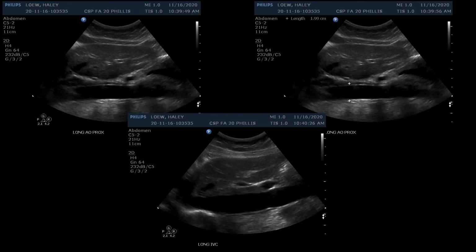My aorta could have been more elongated and showed a better connection to the SMA. I could have also showed a better connection to the heart. Using TGC would have cleared out the vessel more. I measured the AO diameter, including the walls in the measurement. Aorta diameter should be less than 3 centimeters. My IVC picture was cleared out well.